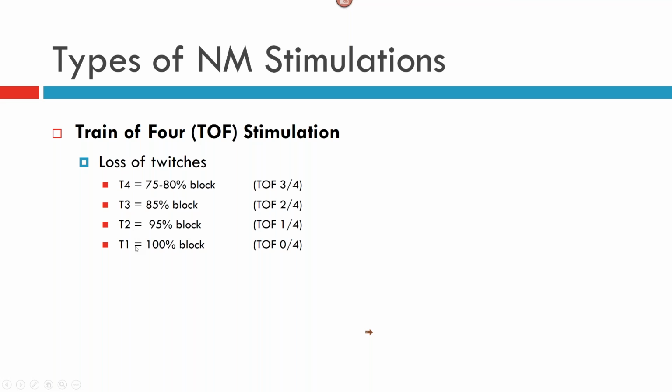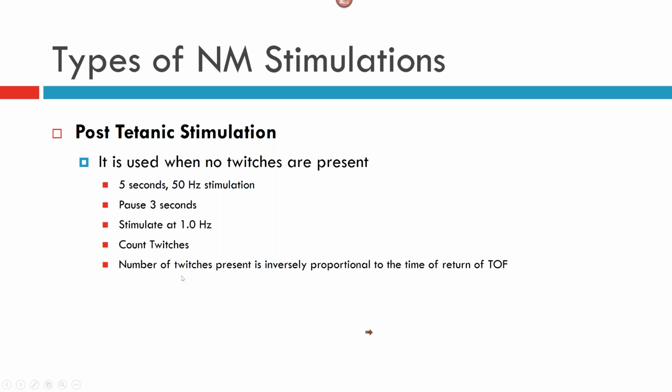The other important thing is when we do MEP, all the data says that when we do cortical stimulation for motor evoked potentials, we recruit only 5 to 10% of the corticospinal tract. So we are recruiting only 5 to 10% of fibers. We cannot recruit more than that due to anatomy. And if 80%, 90% of muscles are paralyzed, then you are monitoring less than 2% of muscles and giving the wrong information to the surgeon and to the patient.